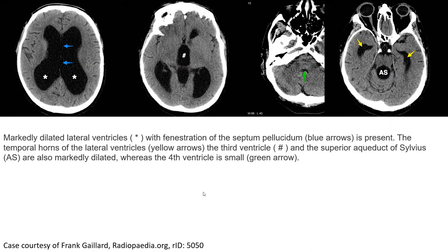This is a CT case. Markedly dilated lateral ventricles with fenestration of the septum pellucidum is present. The temporal horn of the lateral ventricle, the third ventricle, and the superior portion of the aqueduct are also markedly dilated, while the fourth ventricle is small.